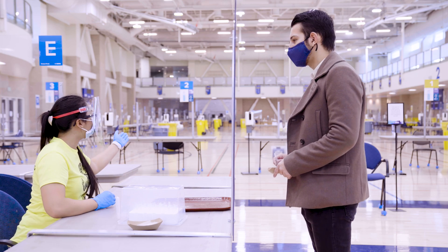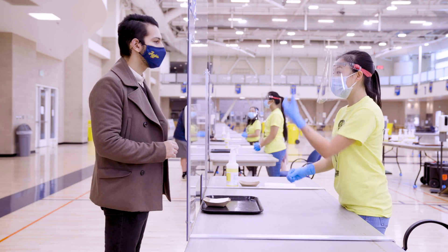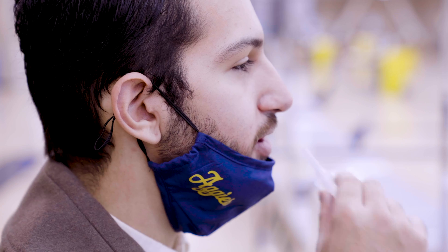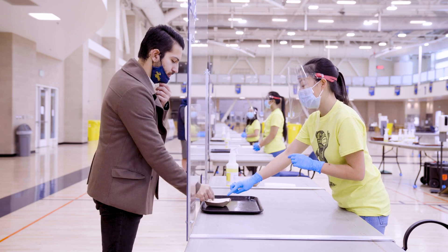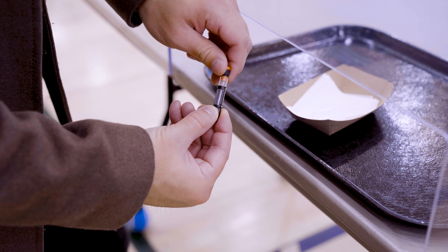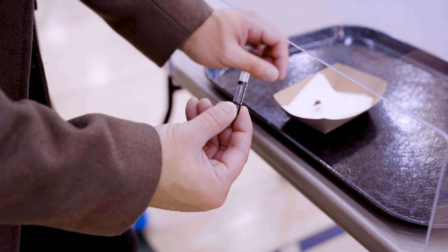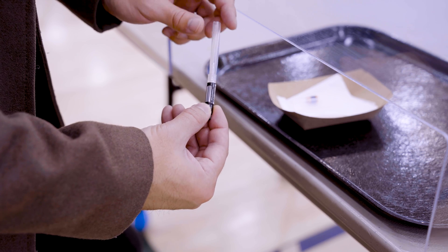You'll then be directed to a testing table. When prompted by the attendant, lower your mask and tip the water from the pipette bulb into your mouth and gently swirl it around. Don't swallow or gargle the water. Place the empty pipette bulb into the container provided. Unscrew the cap from the vial and place the cap in the container. Insert the straw into the vial, being careful not to push the straw so far that it creates a seal.